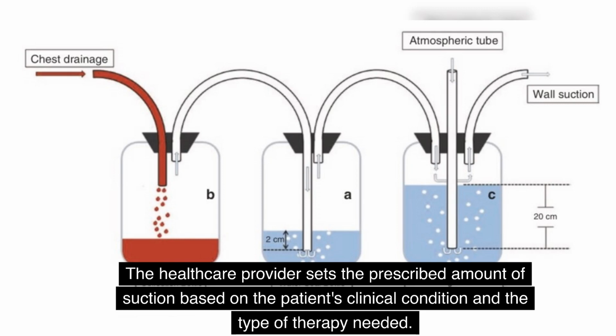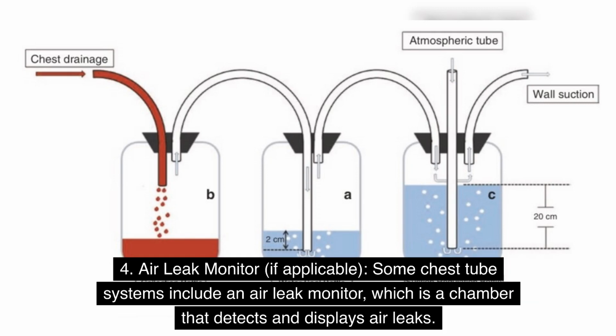The healthcare provider sets the prescribed amount of suction based on the patient's clinical condition and the type of therapy needed. 4. Air leak monitor, if applicable.